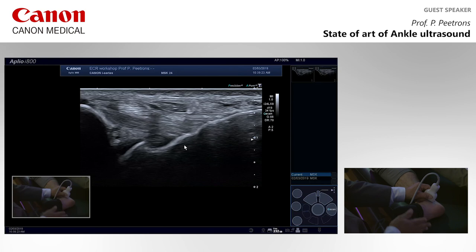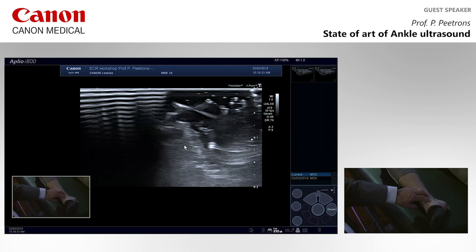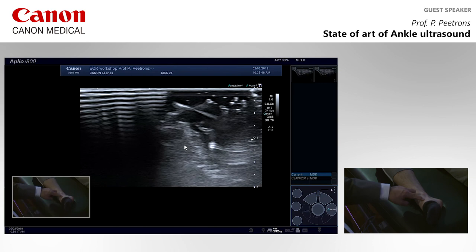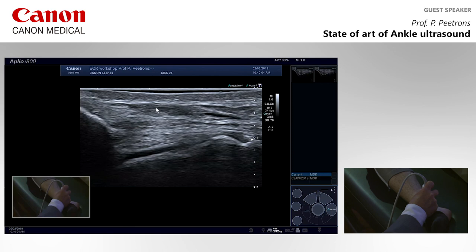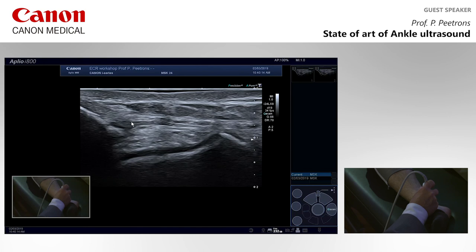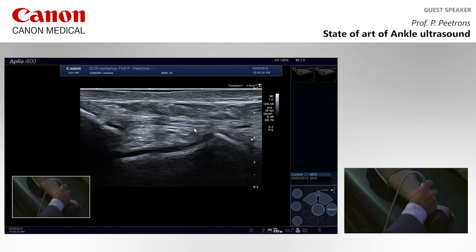It is exactly the same for the anterior part of the deltoid ligament, okay? So when you are looking to the anterior tibiotalar or tibionavicular ligament, what is the good position? Is it like this? Or like that? Of course it's like that, because you open the gap between the navicular bone and the tibia. So if you want to see the anterior tibiotalar ligament, you have to open the gap between the tibia and the talus. So here is the talus, the anterior part of the talus. Here is the tibia. And when he opens the gap, you can see a little bit of the anterior tibiotalar ligament, which is coming from here and going there. It's a very, very thin ligament, going to the anterior talus, exactly there.